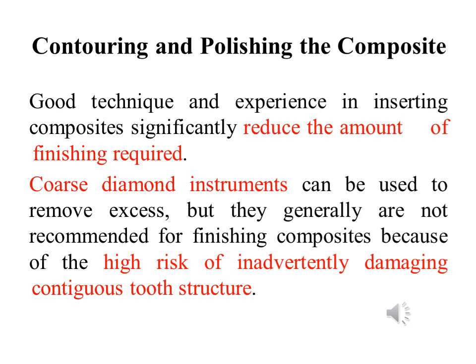Coarse diamond instruments can be used to remove excess, but they generally are not recommended for finishing composites because of the high risk of inadvertently damaging the contiguous tooth structure.